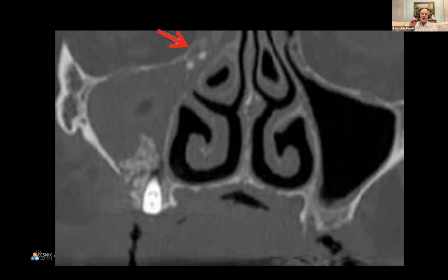So again, you want to go just superior to the infraorbital rim and then the occlusal plane. Most midfield view CBCT units will put you in that position, no problem. Therefore, if we do have to send this to an ENT, the ENT can easily verify it and treat the patient. If not, what happens is the ENT will say they have to take another scan, and now the patient is coming back and could possibly be upset that they have to be rescanned. So do it right the first time, and that will alleviate any further problems.